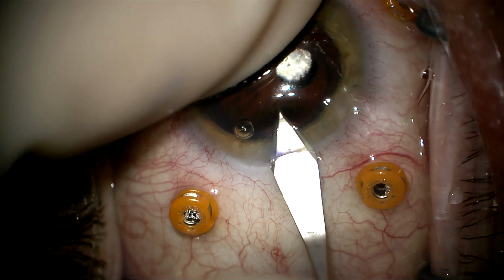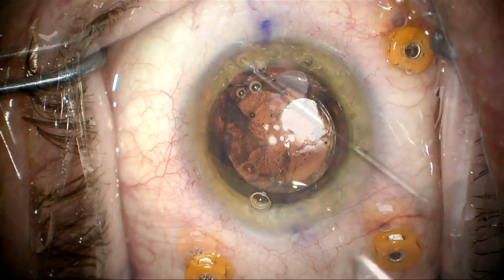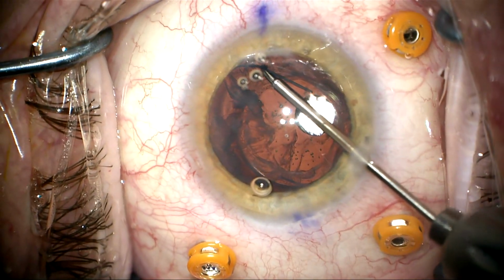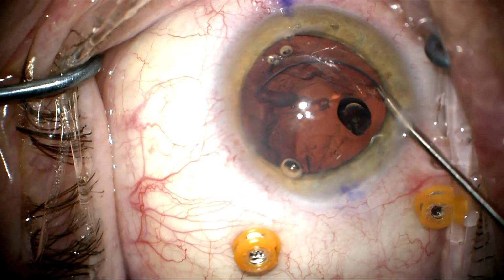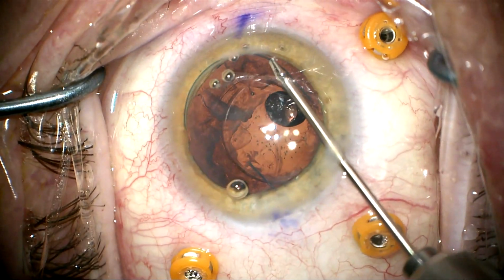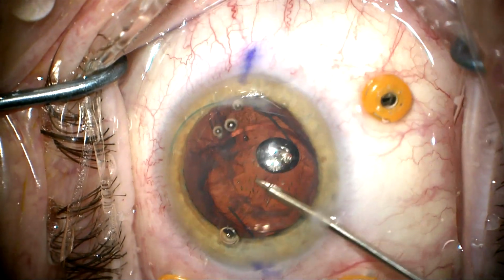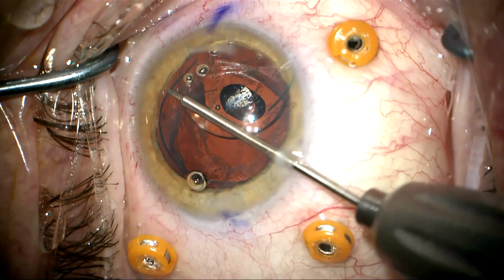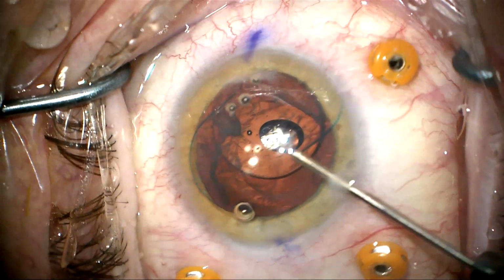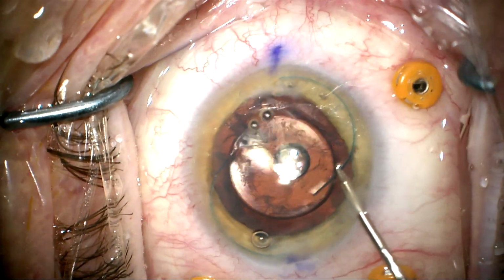Now I'm going to make my clear cornea incision with the 2.75 millimeter keratome so I can take out the lens. This is a micro grasper, and I'm able to now pull this haptic out of the equator of the capsular bag remnant. We can now remove the other haptic in the same fashion, just pulling this out of the capsular bag remnant and bring this up into the anterior chamber.